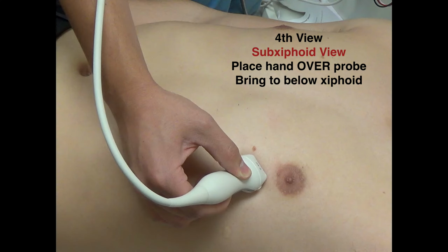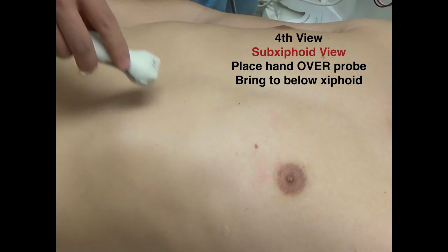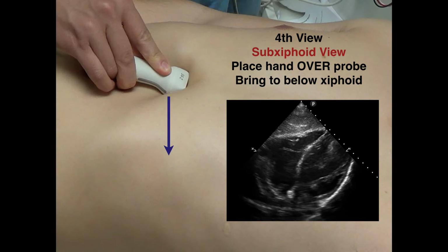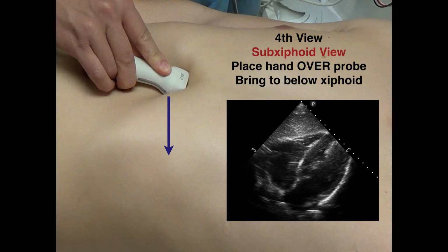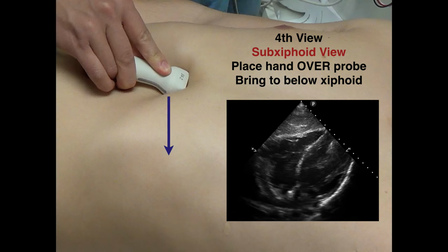And the fourth and last view is, all you have to do is place your hand over the probe and bring it just below the xiphoid. So I'm placing my hand over the probe, starting to the right, and sweeping in. Once again, the indicator is still towards the patient's left. You want your hand over the probe because if your hand is underneath the probe, you might not be able to get the right angle. You see how close the probe is to the patient's skin, because it's a really shallow angle when looking for the subxiphoid view.